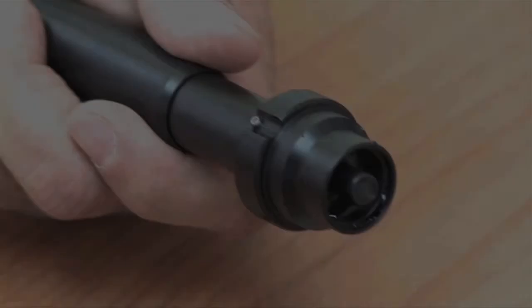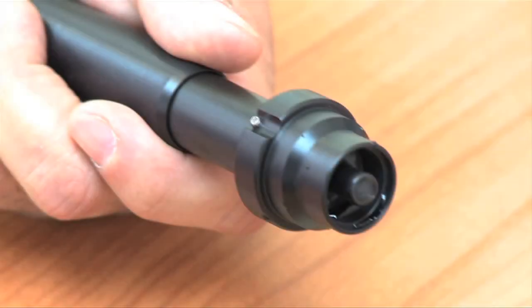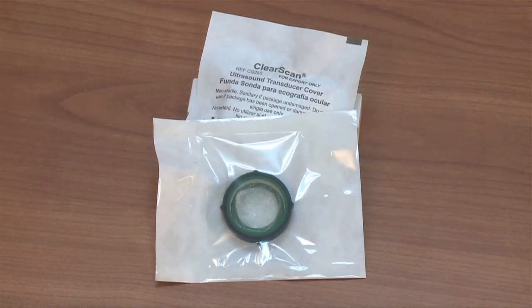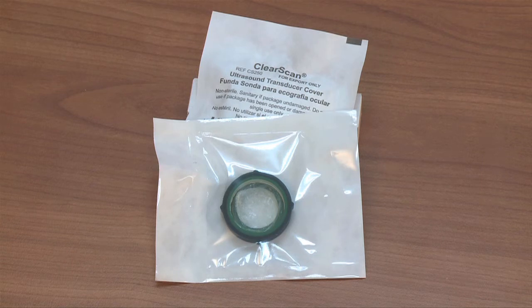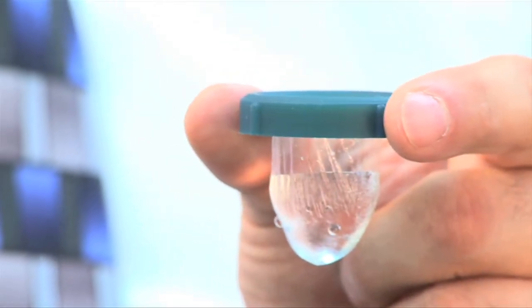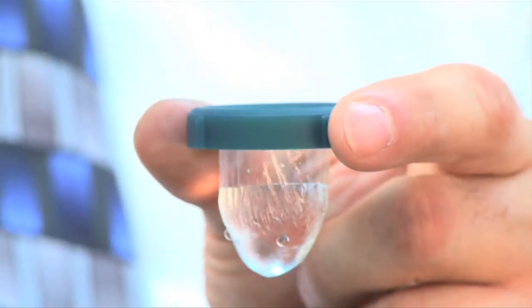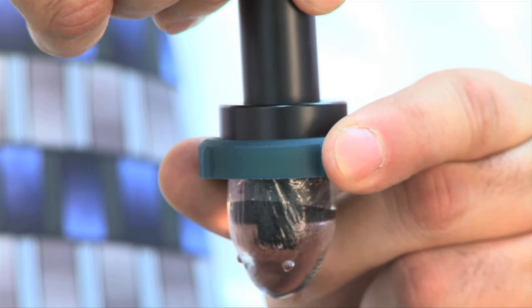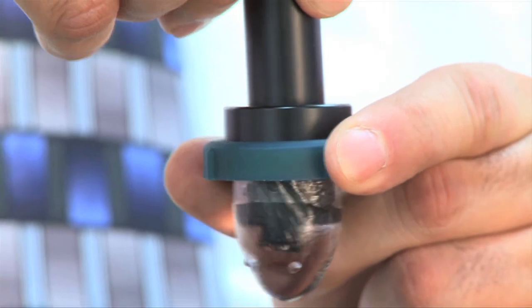The 40 MHz probe is open and the transducer is visible. The probe can be used in several ways. This configuration is for use with the ClearScan bag. The bag is filled as shown with distilled water and the probe is inserted.